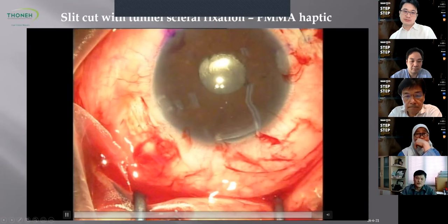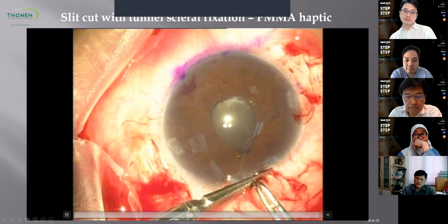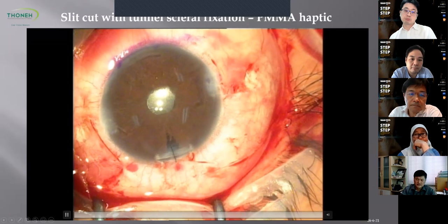In this case, this is a post-vitrectomized eye, so I only do a PI at the end of the procedure surgically, and then I close up the wound. So this is the appearance of the eye at the end of the surgery, okay? So this is how a slit cut with tunnel scleral fixation is done.